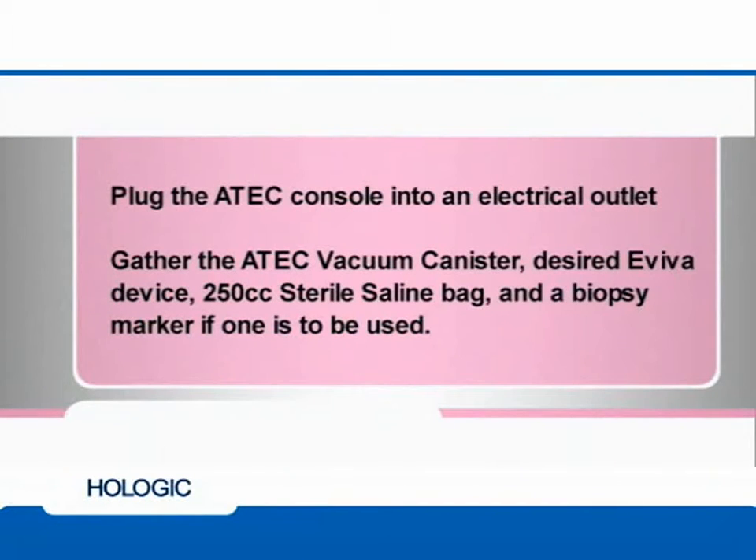Begin by plugging in the ATEC console to the electrical outlet. Gather the ATEC vacuum canister, desired Eviva device, 250 cc sterile saline bag, and a biopsy site marker if one is to be used.